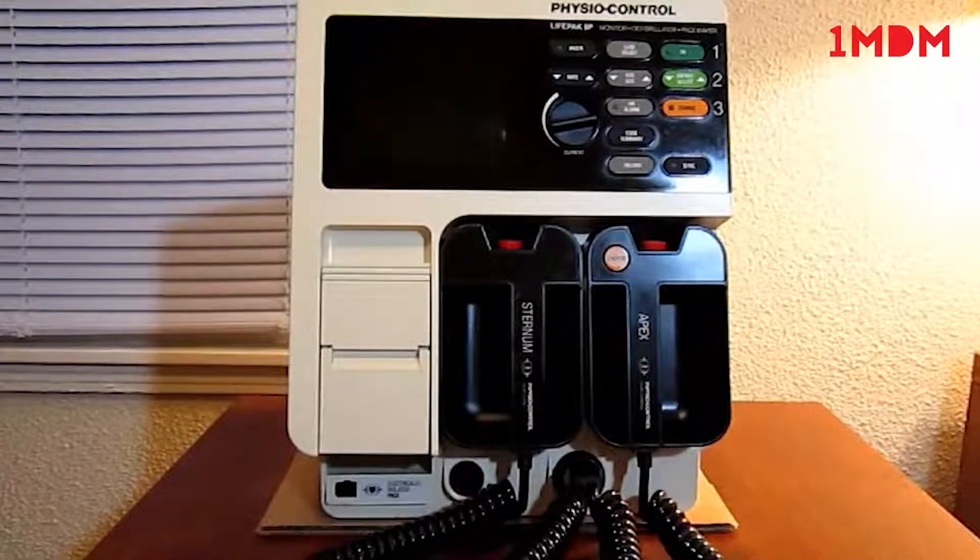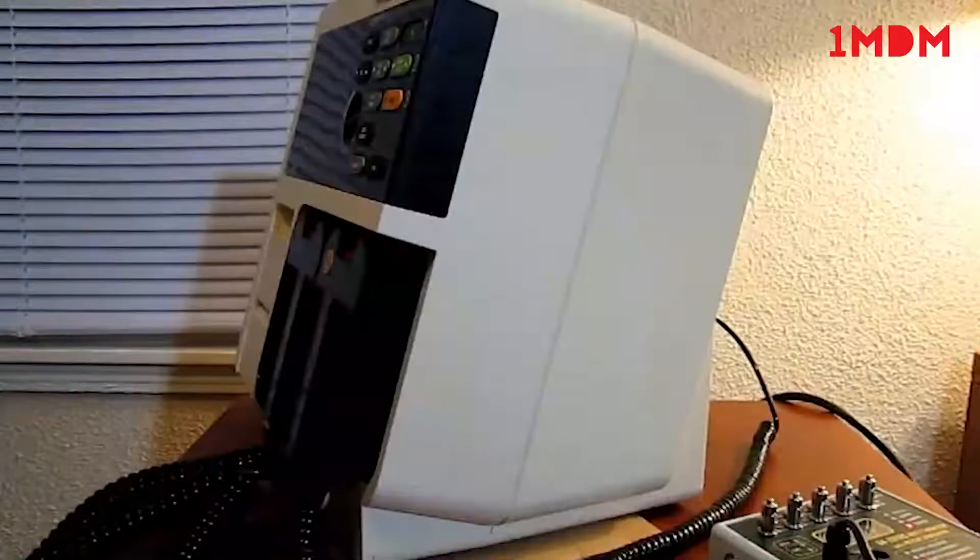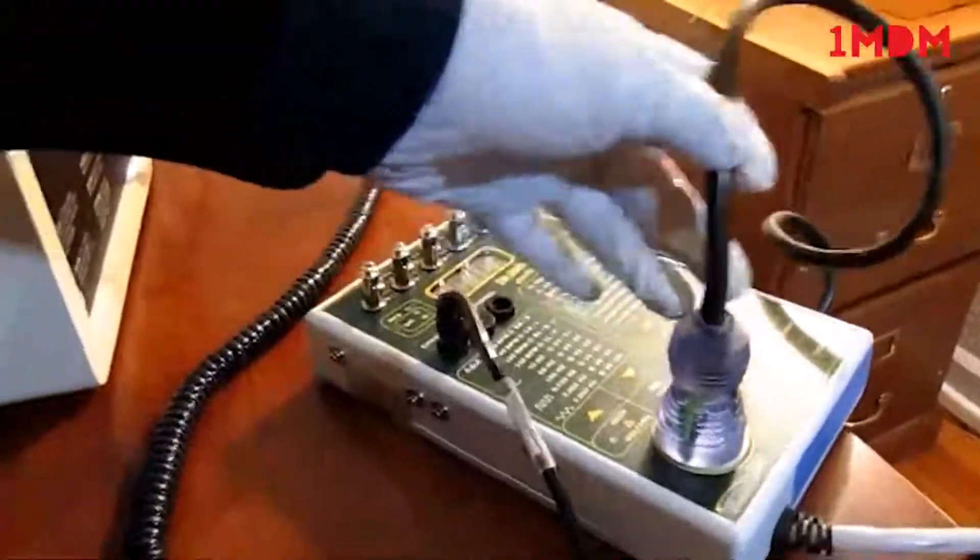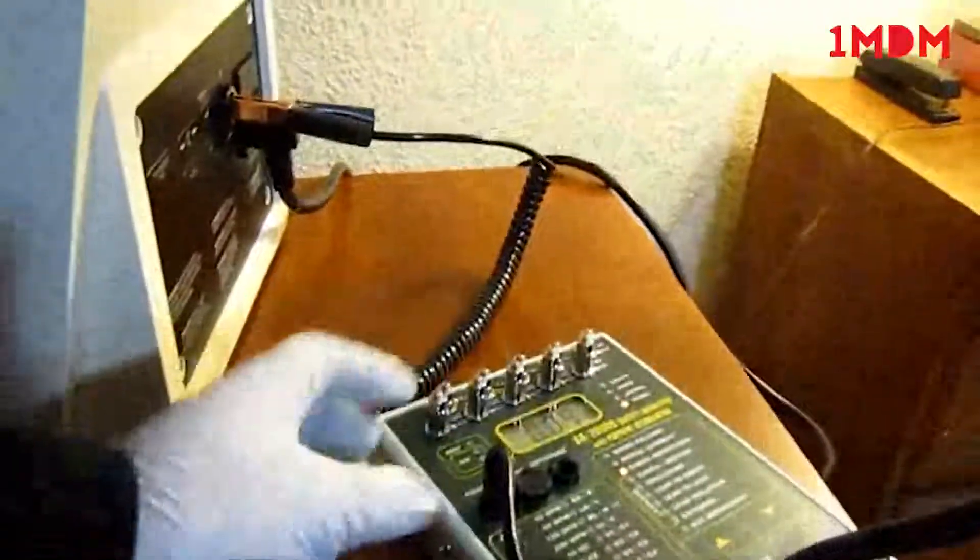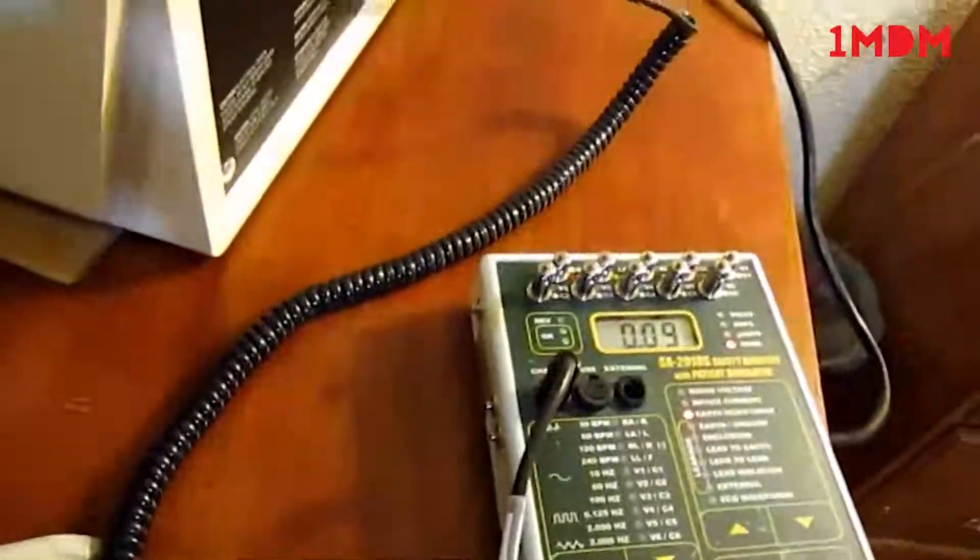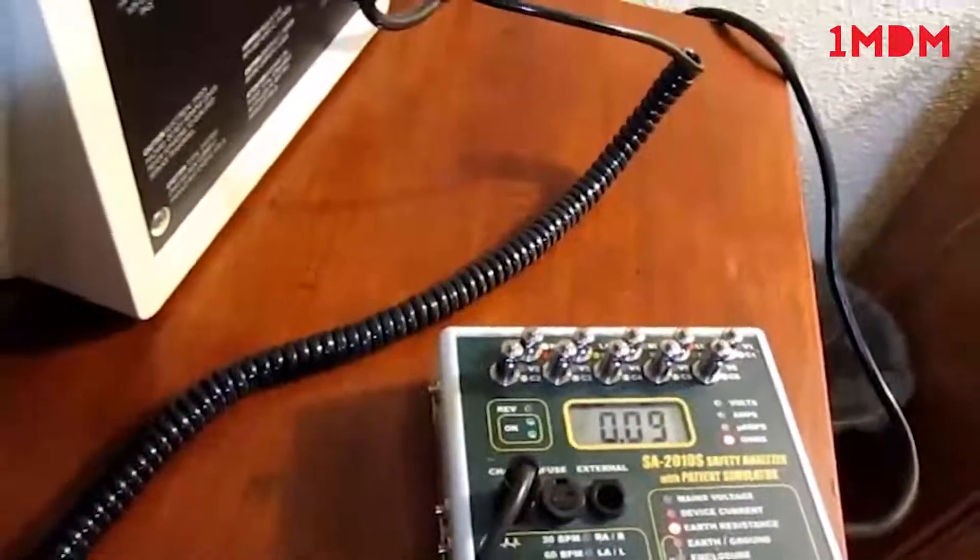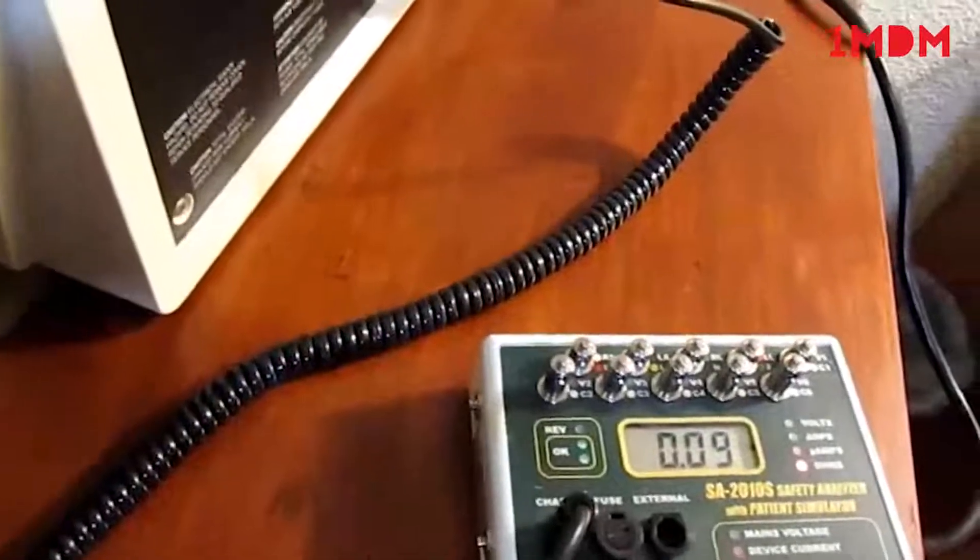So now we're going to do a function test. We have our safety analyzer hooked up to this unit. This unit does come with its own power cord, which is in really good shape as well. For the resistance of the power cord, the OEM recommends less than 0.5. We're getting 0.09 ohms.